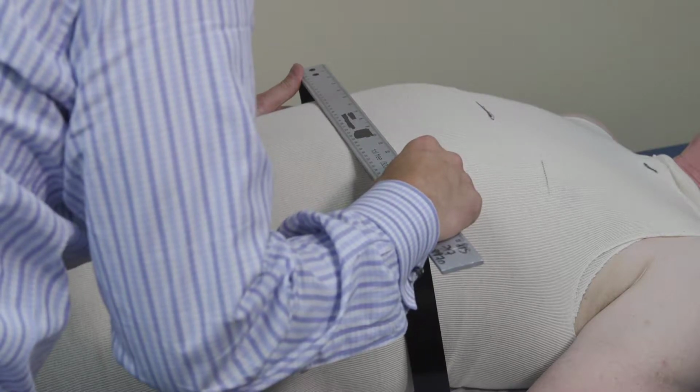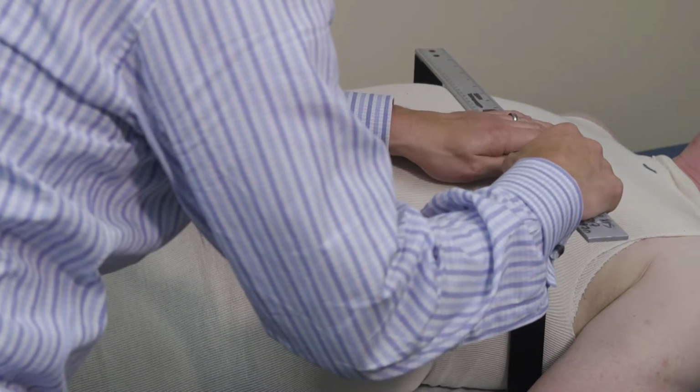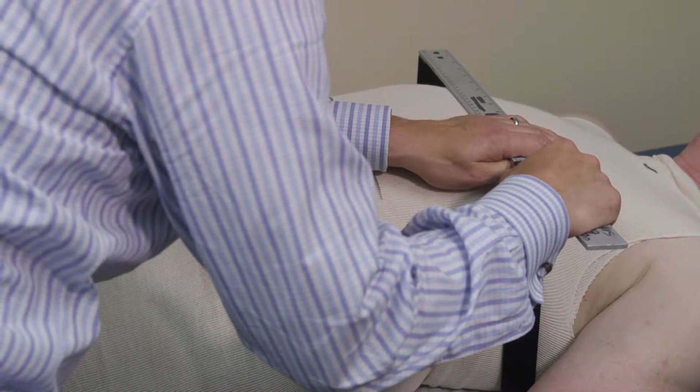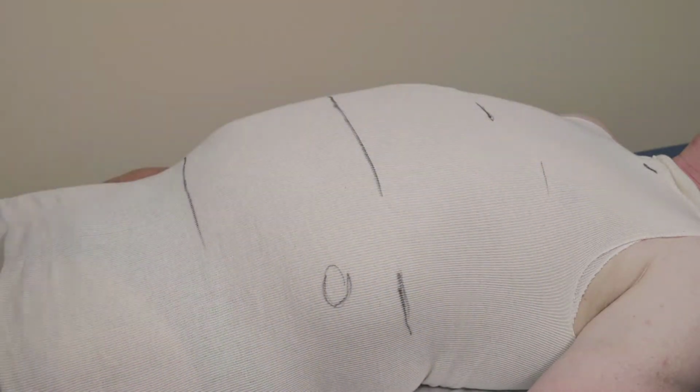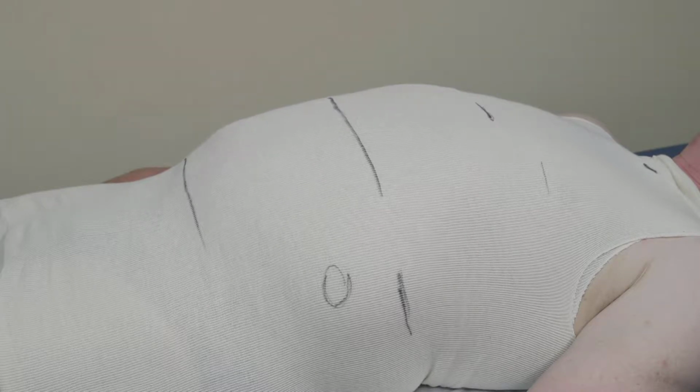We'll say 14 7/8 at the waist and 15 at the xiphoid. So essentially 15 in both, but we'll do 14 7/8 and 15. Now our heights are going to come into play again as well.